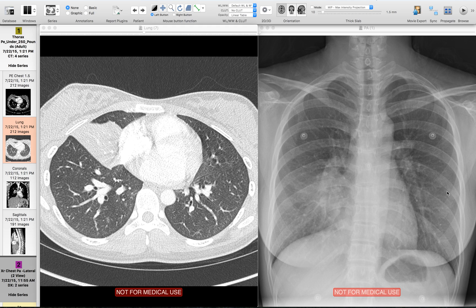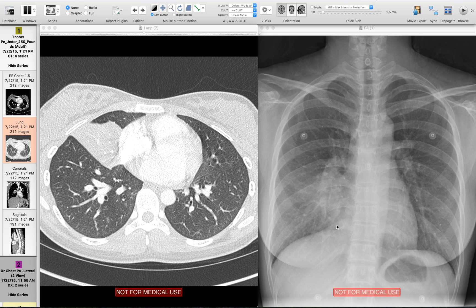In this example, we lose the right heart border. If we take what we know about the lobar anatomy, we can predict where this opacity is — we don't even need a lateral view. The right heart border is immediately adjacent to the right middle lobe, so we can say with certainty that this opacity is in the right middle lobe.